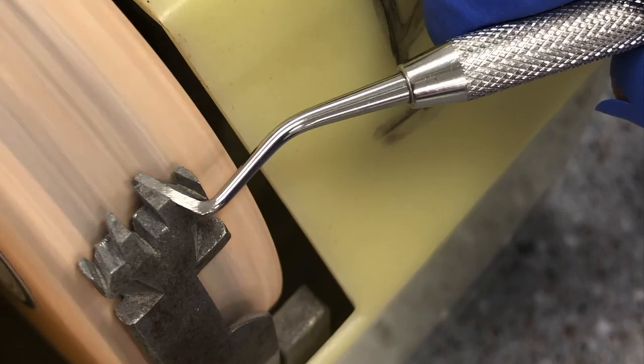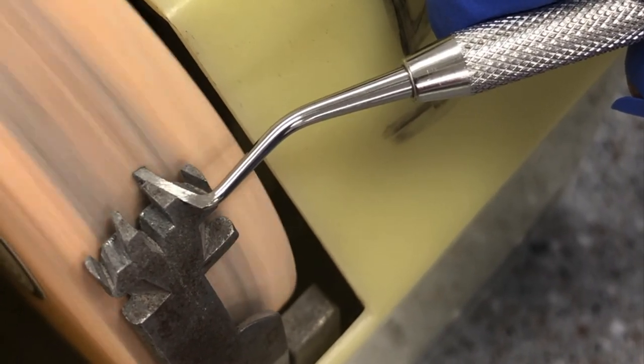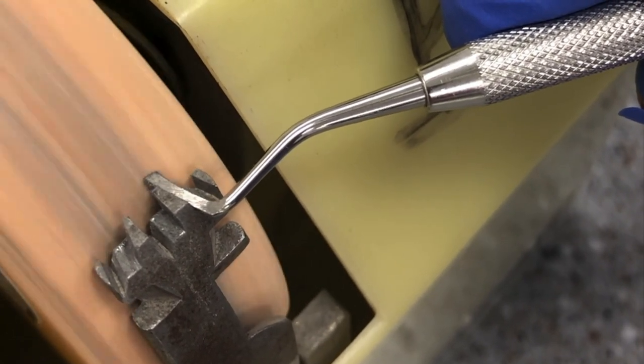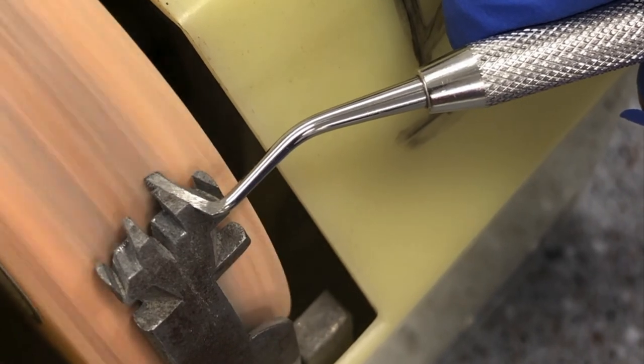With the machine on, position your blade within the guide and gently push it against the wheel. The wheel will move back and forth to ensure even wear on the grinding stone.